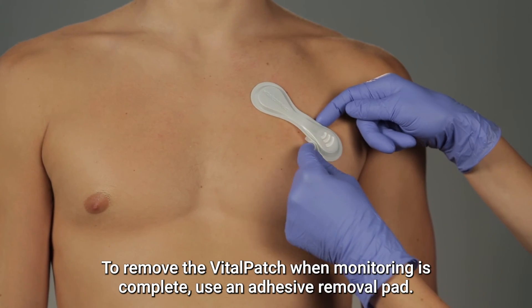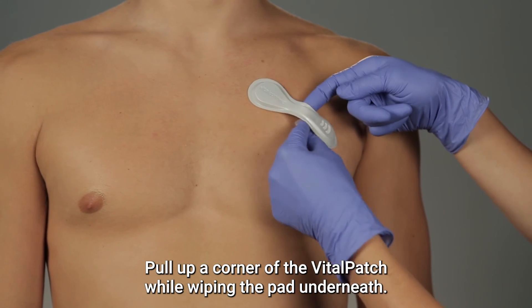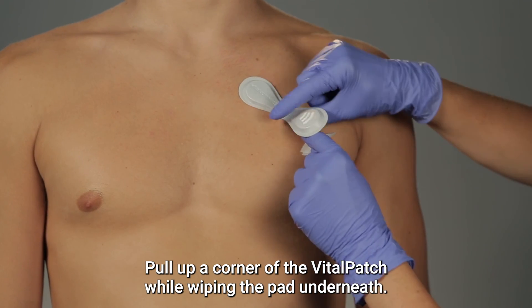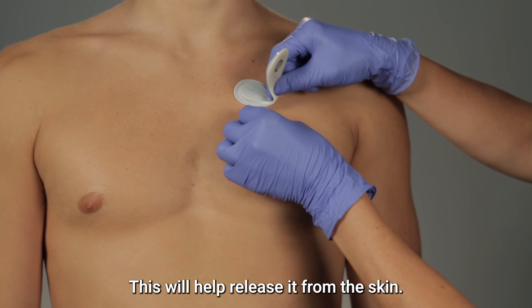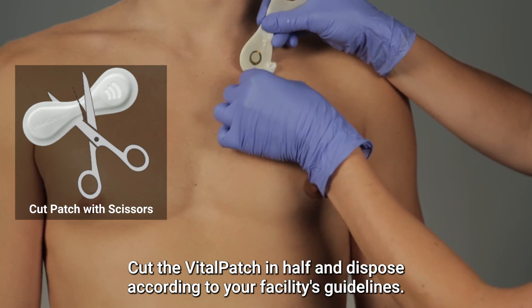To remove the Vitalpatch when monitoring is complete, use an adhesive removal pad. Pull up a corner of the Vitalpatch while wiping the pad underneath — this will help release it from the skin. Cut the Vitalpatch in half and dispose according to your facility's guidelines.